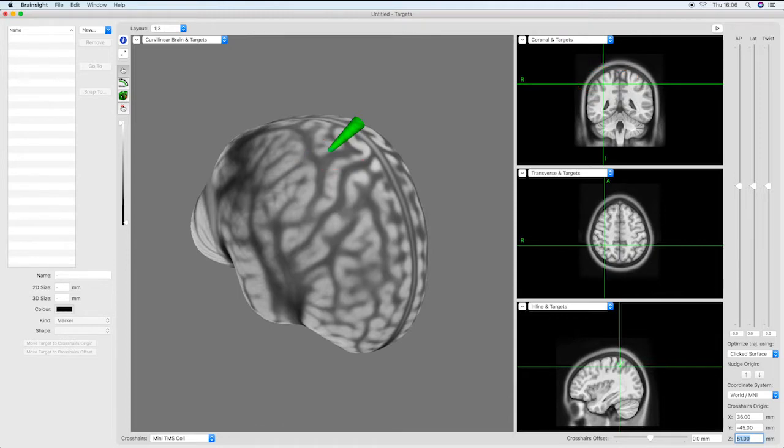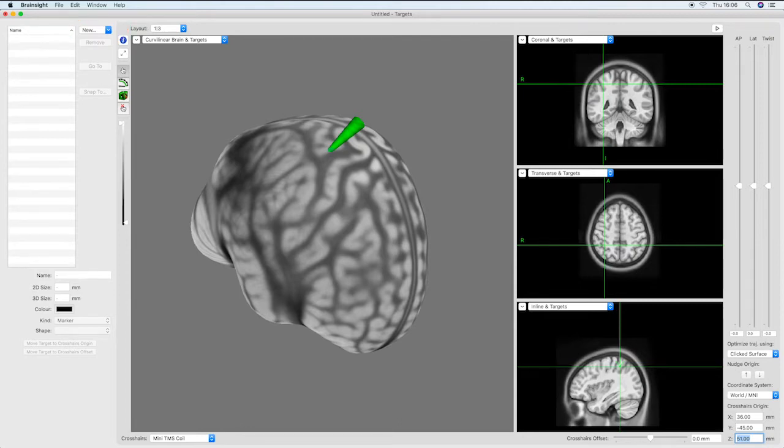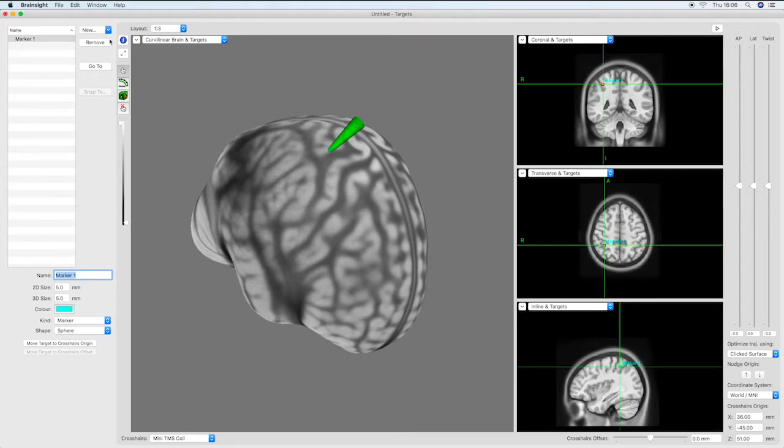It is possible to save this location as a marker using the new button at the top left of the screen. Although it is possible to use a marker as the basis for coil positioning, it can also be helpful to define a trajectory to make the navigation more accurate and reliable.